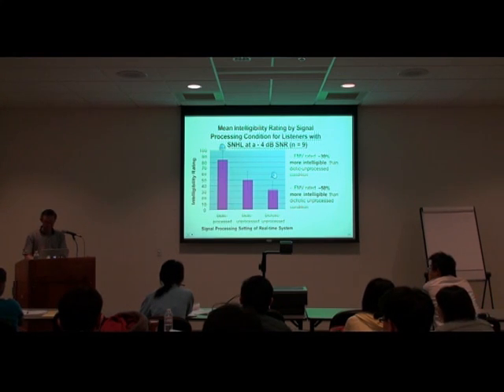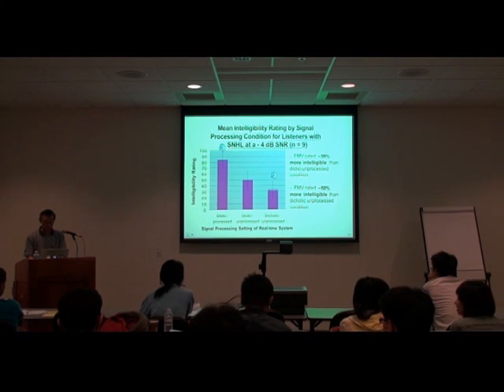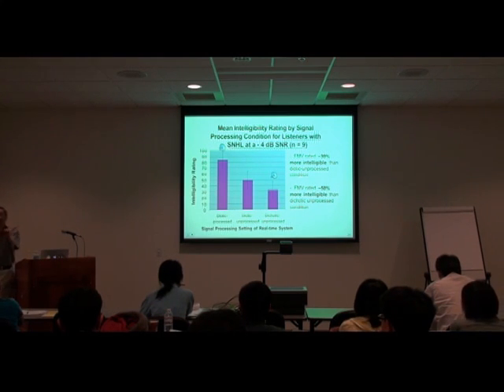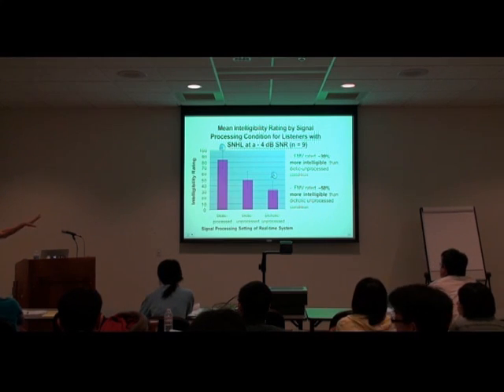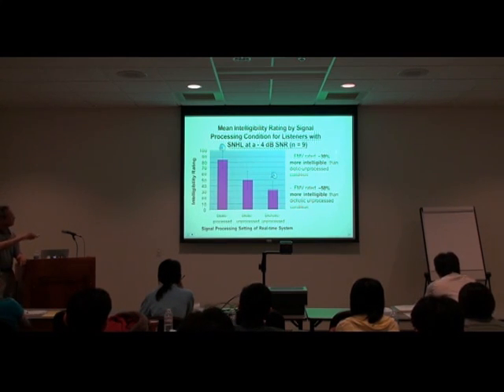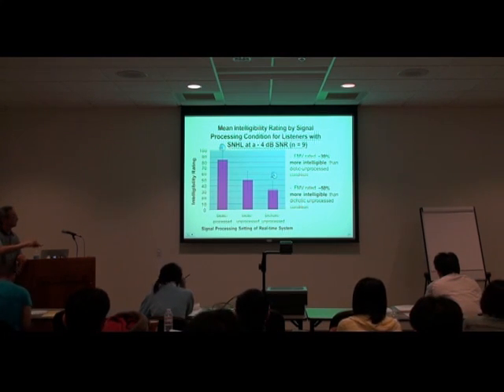It's difficult, but once it's processed, okay, so how much elevated is the signal, and the competing sounds are totally suppressed. So you can see that actually most subjects with SNHL will actually make the signal 50% more intelligible than that kind of unprocessed signal.